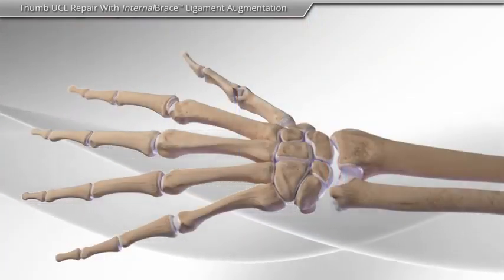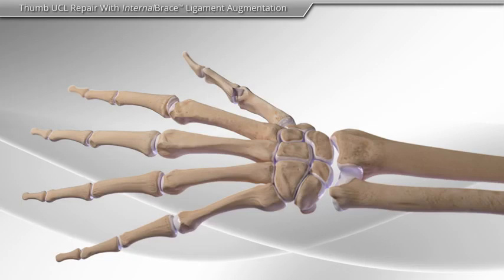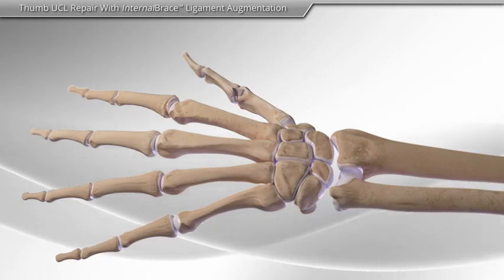Thumb ligament tears are common sports-related injuries. These tears need to be repaired to restore the normal function of the thumb.